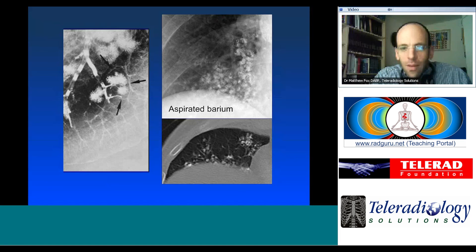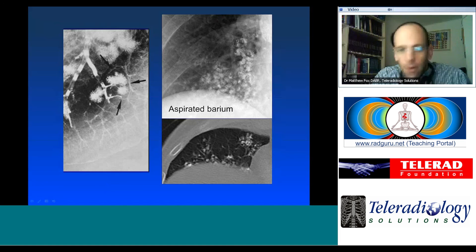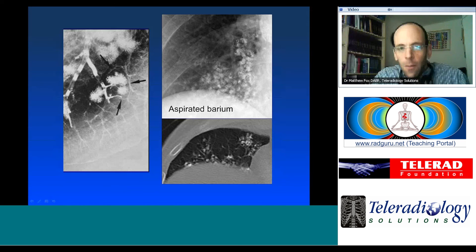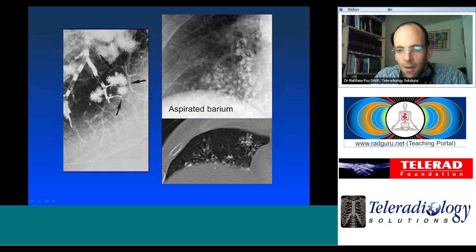In cases of aspirated barium, plain films and CT images do a great job of demonstrating all the structures just described: a bronchiole leading into a membranous bronchiole, a terminal bronchiole, and then a respiratory bronchiole leading into the acinus. This CT demonstration uses aspirated material to highlight these structures.